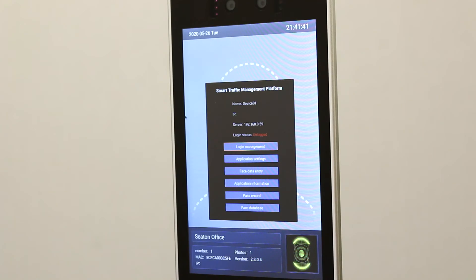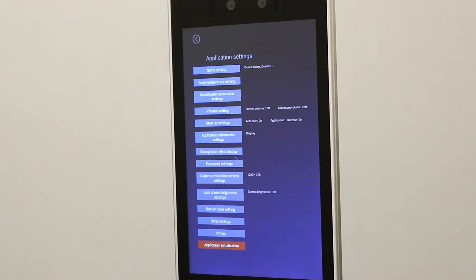Step two, click application settings. Step three, click body temperature settings.